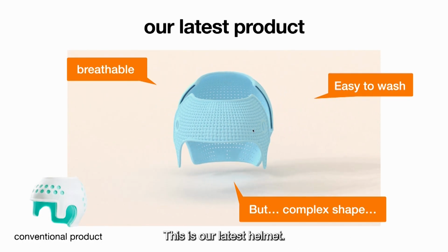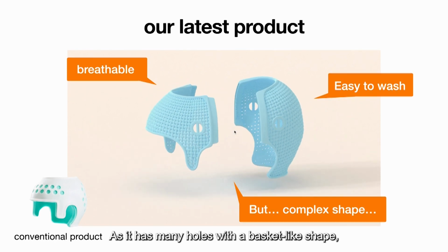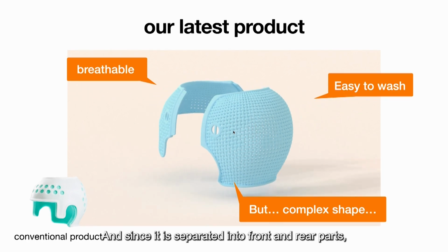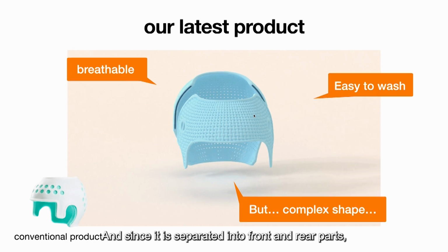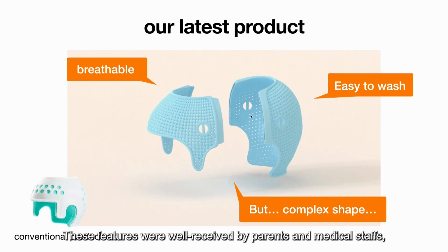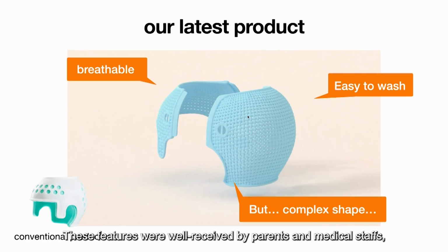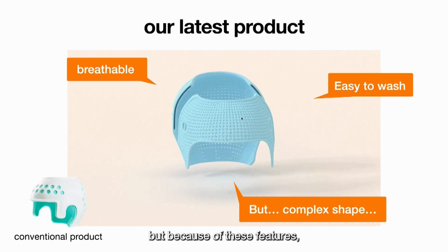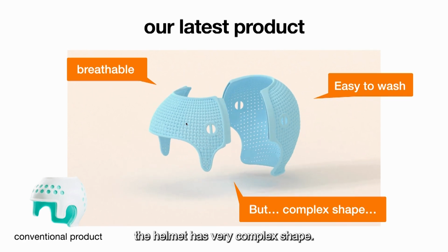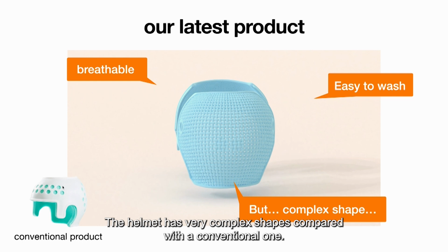This is our latest helmet. As it has many holes with a basket-like shape, the helmet is very breathable. And since it is separated into front and rear parts, it is very easy to wash. These features were well received by parents and medical staff. But because of these features, the helmet has a very complex shape compared with a conventional one.